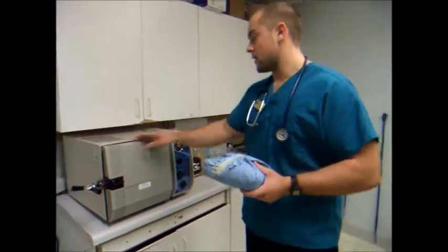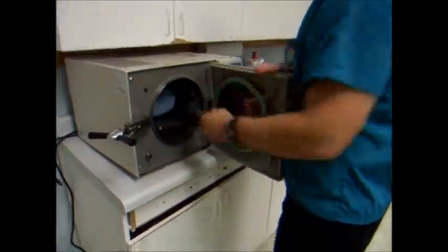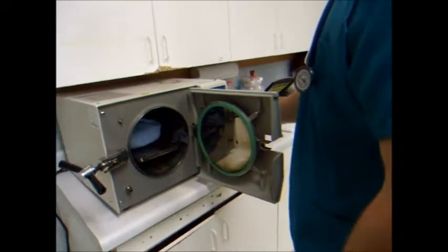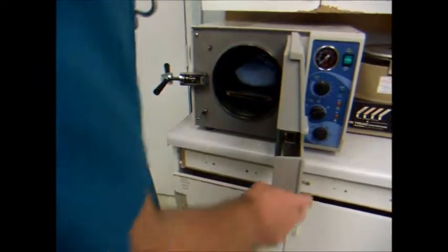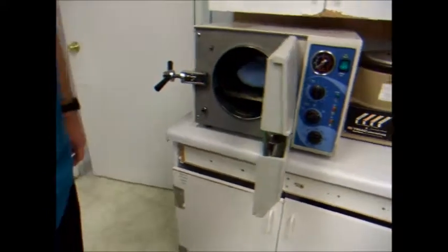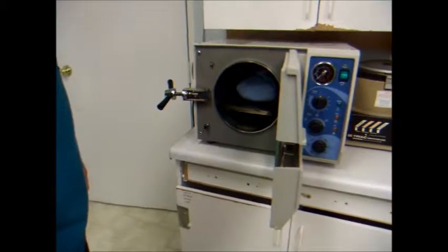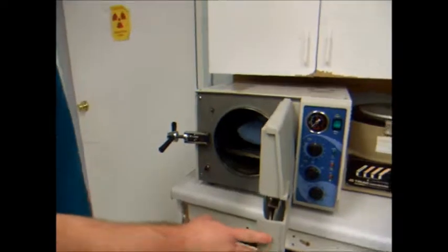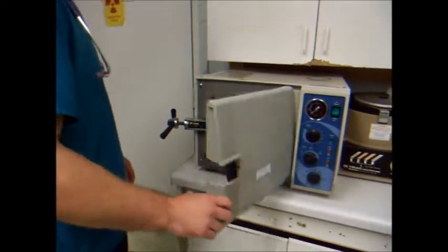Alright, so I'm going to run an autoclave cycle here. Got my pack not sterilized. Put that in there. We're going to run the water here. Fill water until we see it down at this little crack here. So we've made it down there. I'm going to close her up.